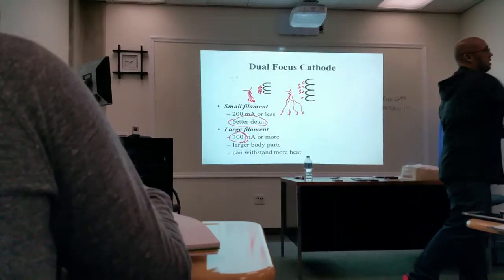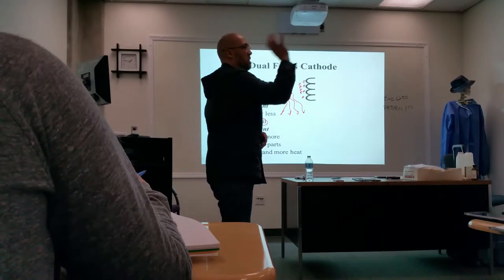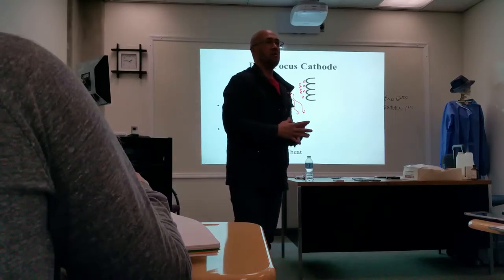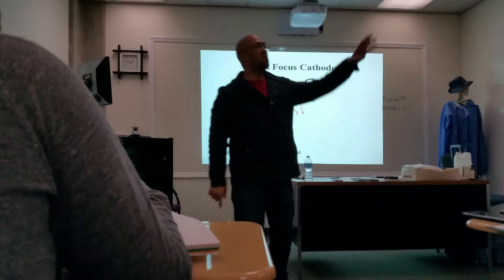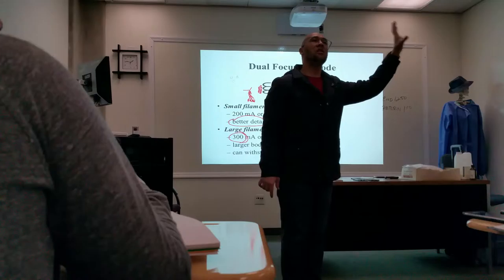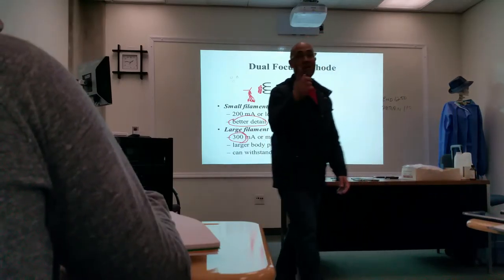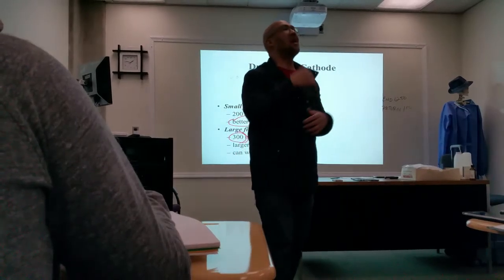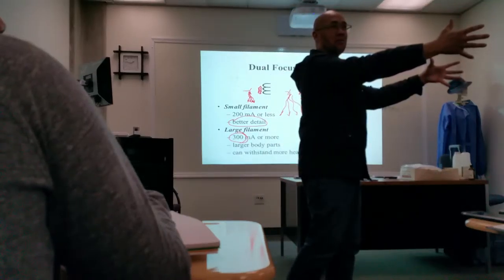Well, let's just start off by painting this one wall here, okay? If I wanted to paint just this one wall, do I need a lot of paint? No. Versus if I wanted to paint the entire room. So if I wanted just to paint this wall, do I need a lot of paint? The answer is no. That's your MA. I don't need a lot of paint, I don't need a lot of MA to color this wall. Follow?